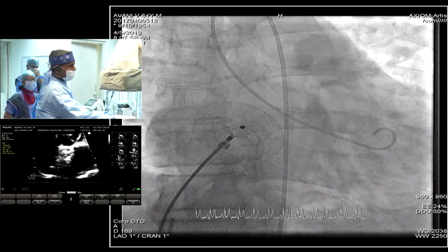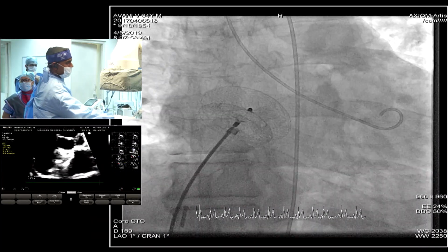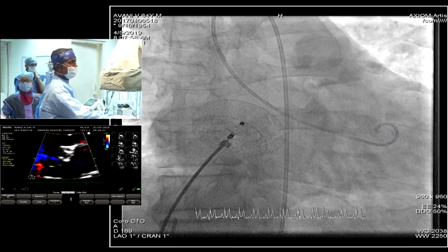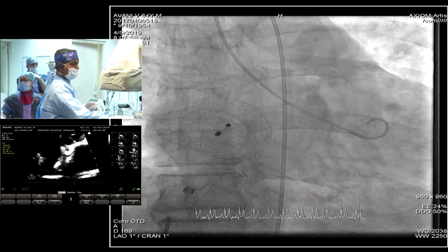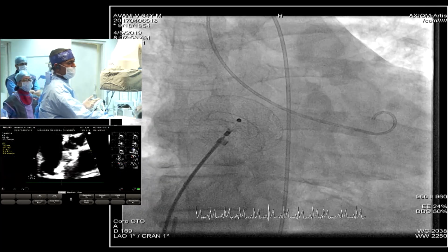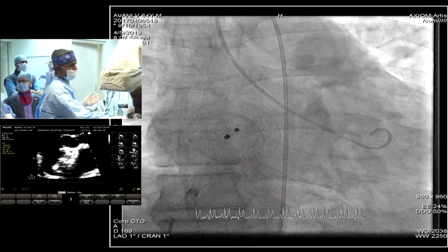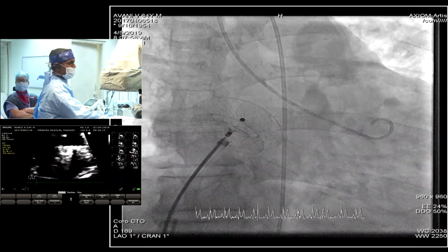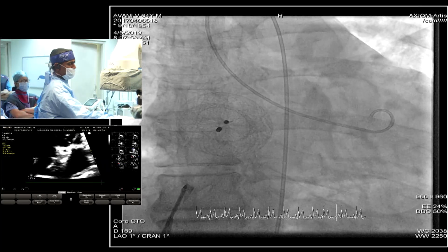Did you give antiplatelet agents? Antiplatelets. Always antiplatelets. The patient will get aspirin alone if the device is reasonably smaller. This gentleman is now 64. He is having a sinus rhythm. He has a reasonably large device of 28 millimeters, which will have around 44 millimeter left atrial disc. So I'll be happy to give him aspirin and Plavix together, and then about 3 months later stop his Plavix, 6 months later stop his aspirin.